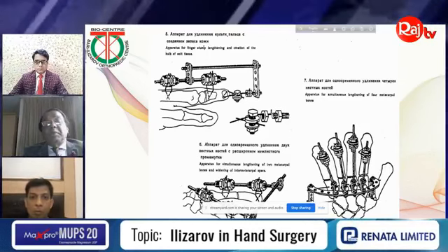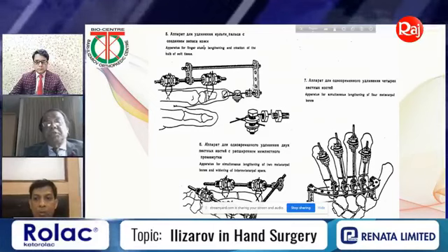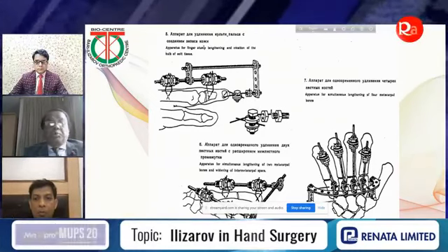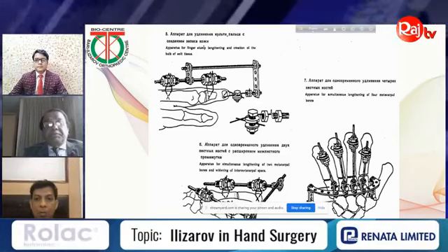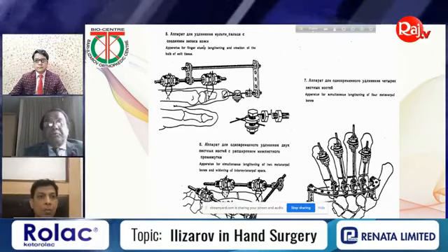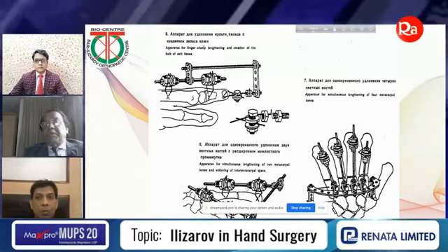These are not normal rings. The Ilizarov big rings. These are the mini fixator only for the hand. Now, dear friend, you can see here, this is the fracture. Think about, you can fix this this way and that way. Very simply, externally, you can do that.